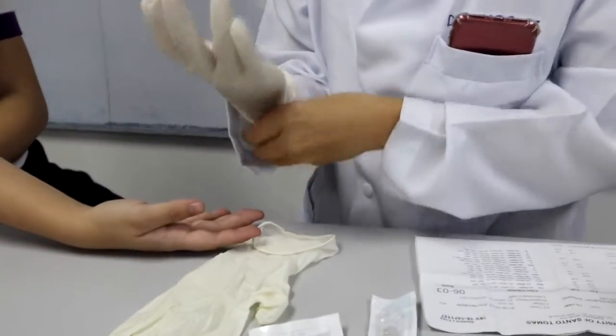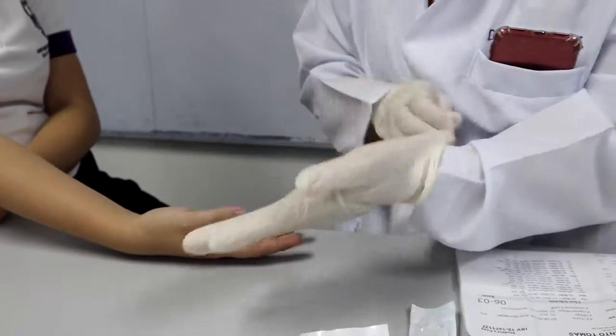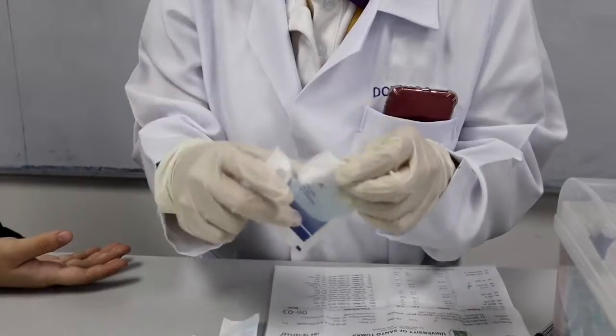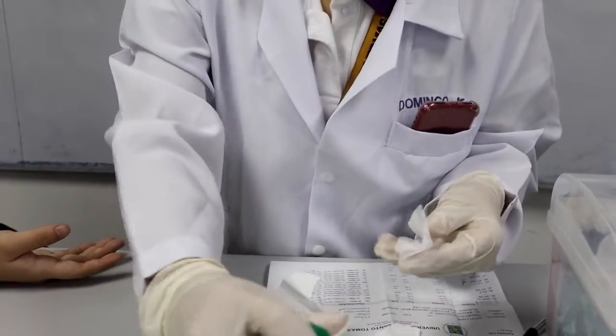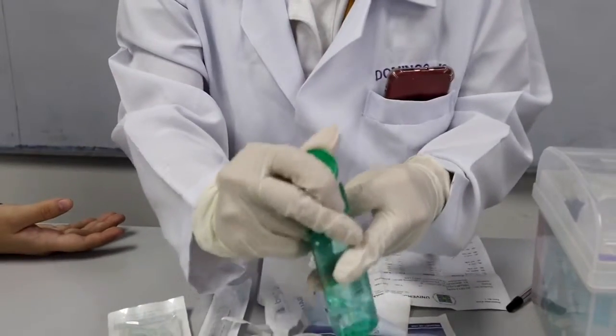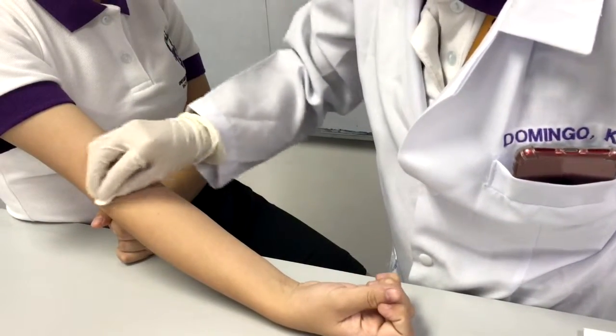Put on gloves on both hands. Note that nitrile gloves are preferred when doing venipuncture. Start cleaning the antecubital area by using either sterile cotton or sterile gauze soaked with isopropyl alcohol, or if the patient is allergic, povidone iodine can be used as an alternative. Apply it in a concentric motion.